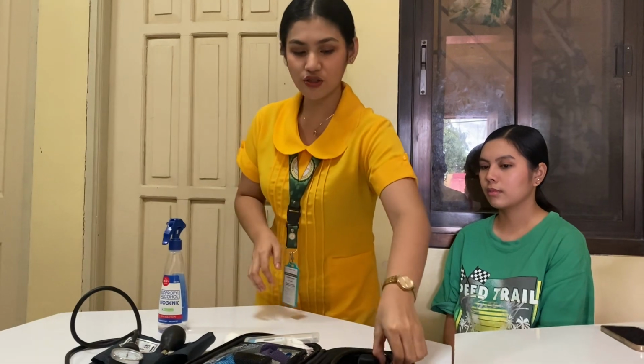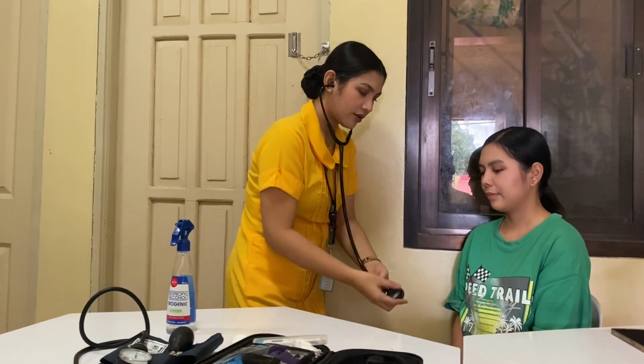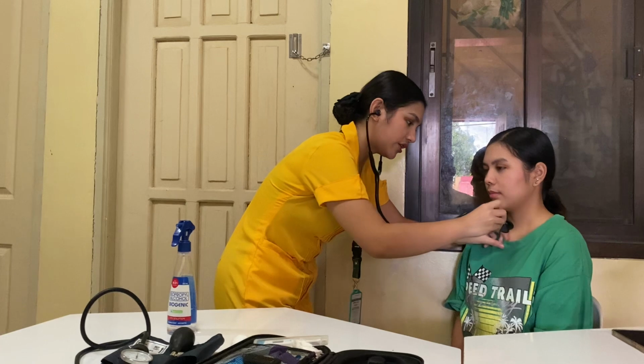For the preparation, we have to assess for clinical signs of hypovolemic shock. So first, we're going to assess the client's apical and then radial pulse for 60 seconds or 1 full minute. So first, we're going to assess the apical pulse, ma'am. I'm going to insert this here.